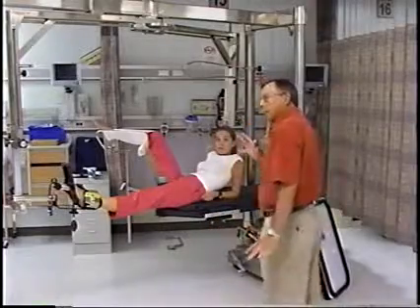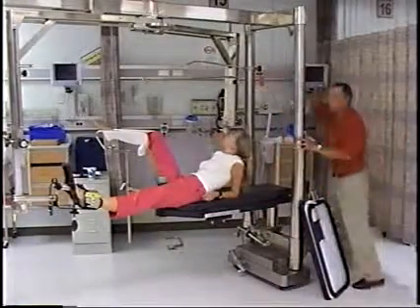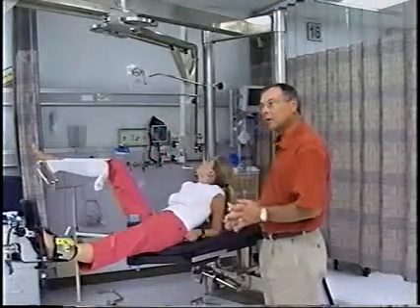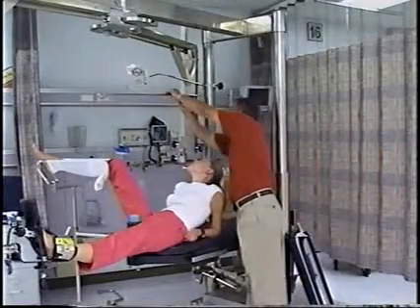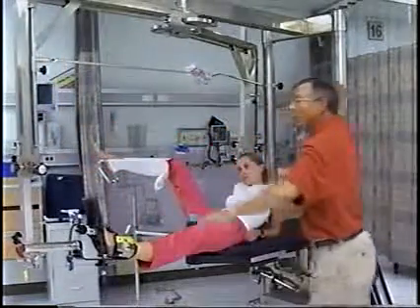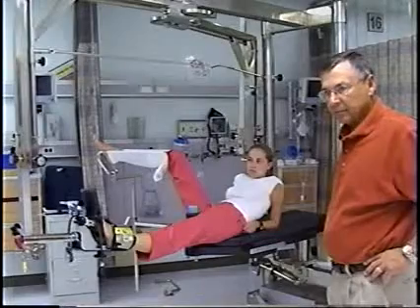The only thing that we didn't set up is on hips. You guys drape here for hips? Okay. These drape rods would be moved to the operative side, and he'll operate outside of the drape, okay? There's one on that pole over there. Yes. What is there one over here? Oh, I see. Okay. And the other one would go over here. Whole unit comes off. Right. The entire unit comes off. All right? That's all there is to setting up a hip on this table. That's all there is.